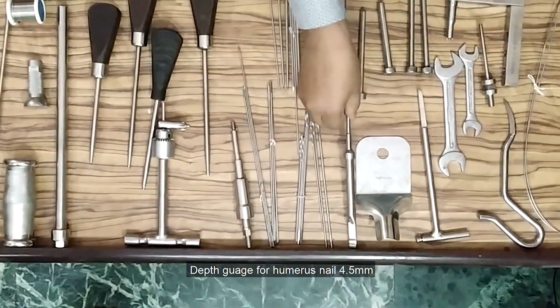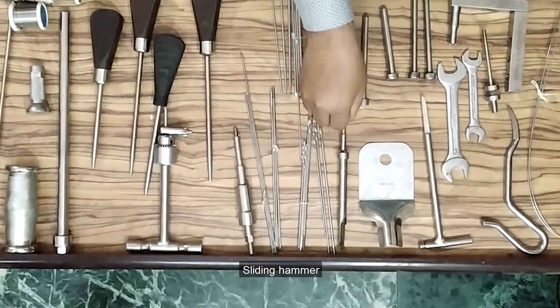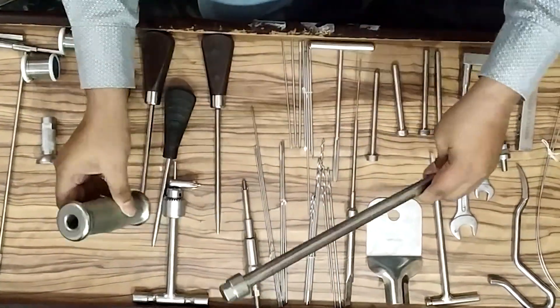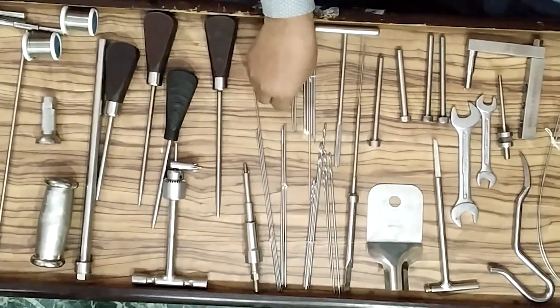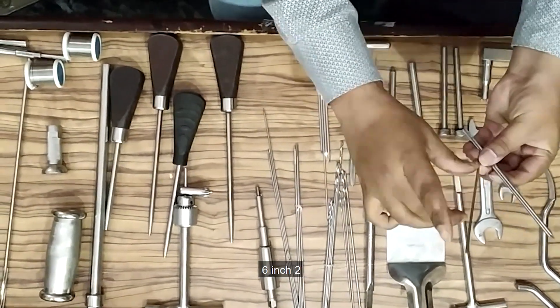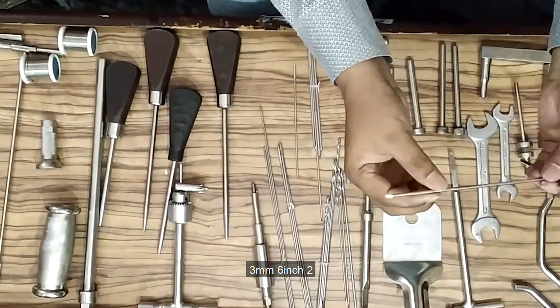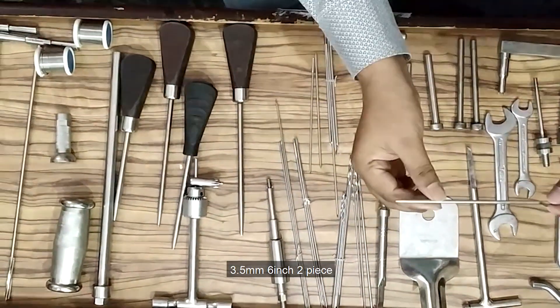Depth gauge for humerus nail 4.5mm, sliding hammer, extractor rod. Stainless steel drill bits: 2.5mm 6-inch 2 pieces and 9-inch 2 pieces, 3mm 6-inch 2 pieces, 3.5mm 6-inch 2 pieces.